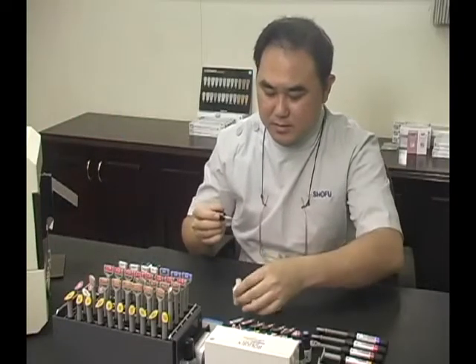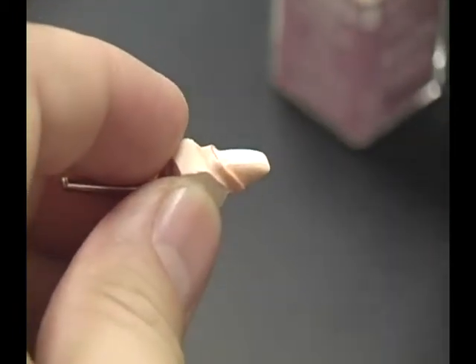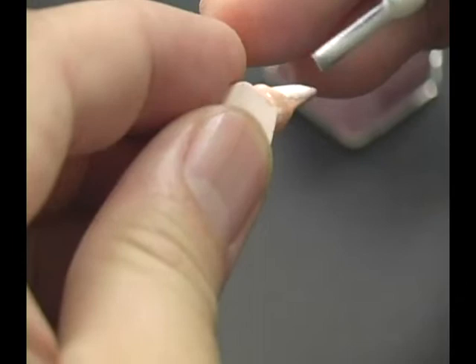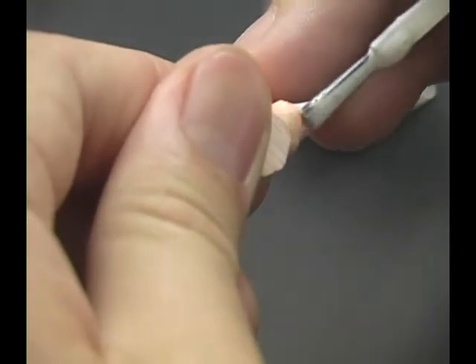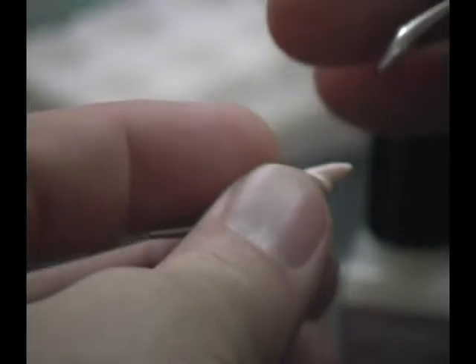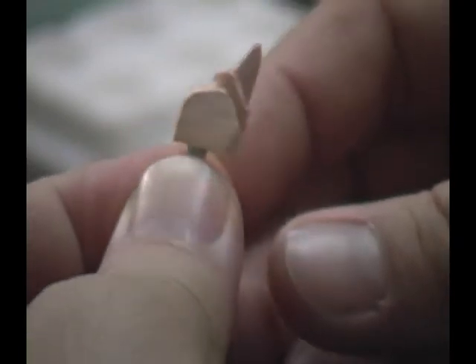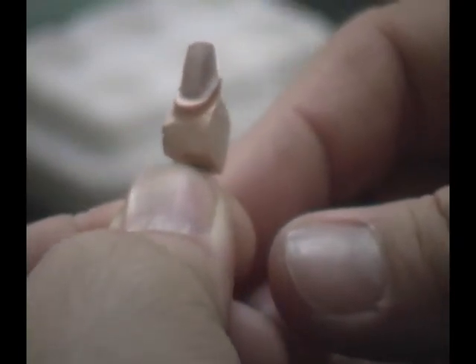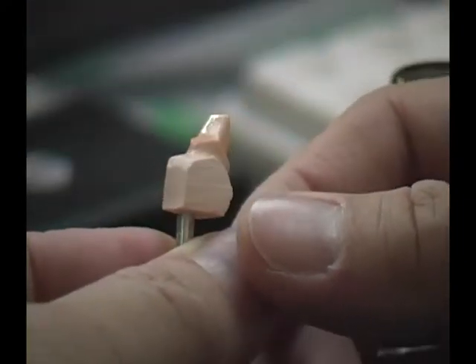Shake the Ceramage Spacer to ensure homogenous consistency. Apply a thin even layer on the die and avoid application on the margin area. This step is important to achieve adequate space for the resin cement during final placement of the restoration. The spacer is designed to change color from milky white to transparent when completely dry, indicating you can proceed to apply the separator.